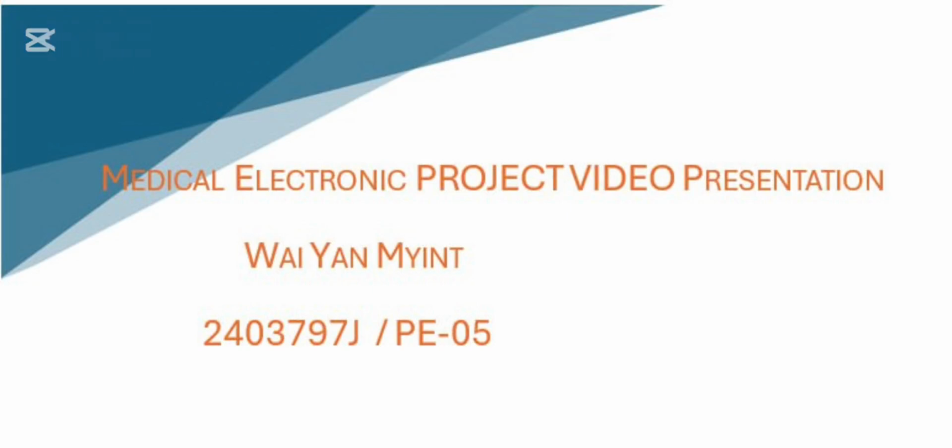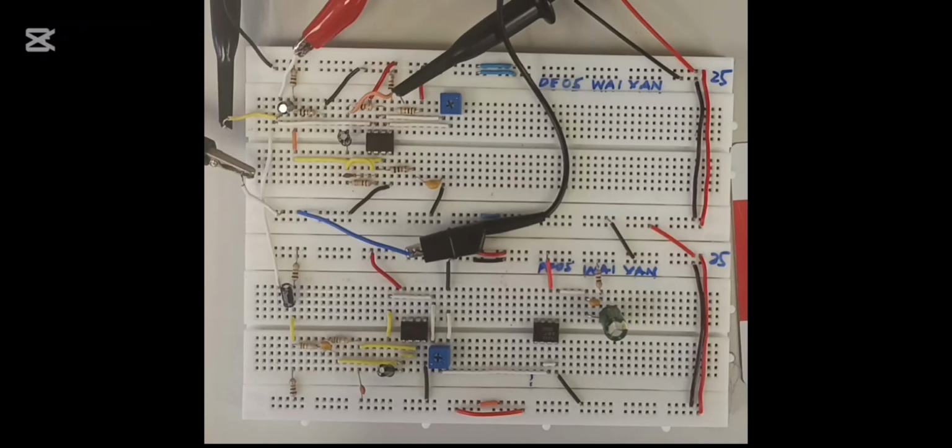Today I'm gonna present my medical electronic presentation video. This is my circuit. It is a biomedical signal processing system used in the stethoscope to acquire the sound of the heartbeat. In this video, I'm gonna explain how the biosignal from our heartbeat passes through this circuit to become a sound that we can hear.